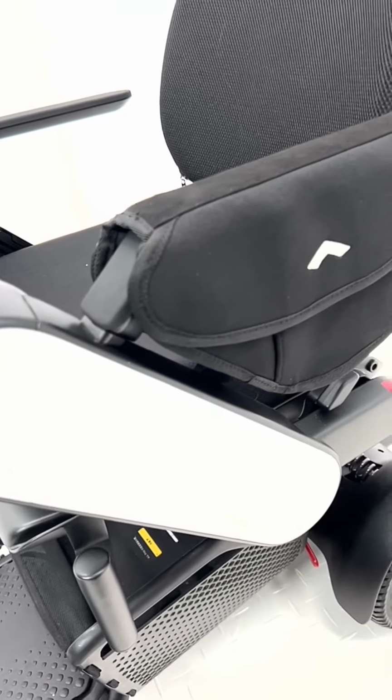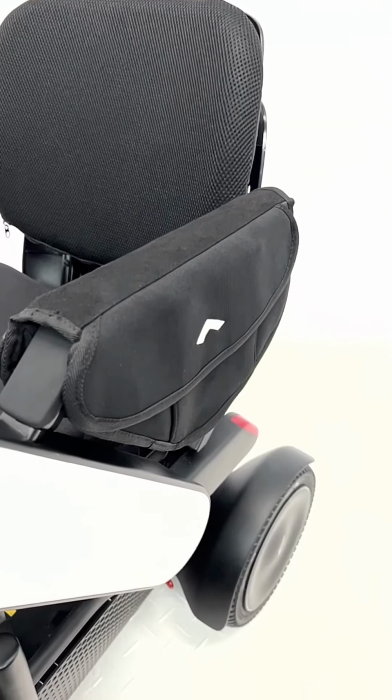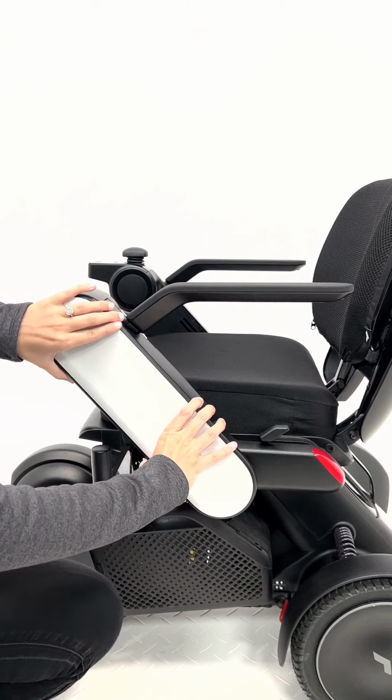Welcome to the installation guide for the sidearm bag of your WHILL Model C2. Let's get started. Carefully remove the arm cover.